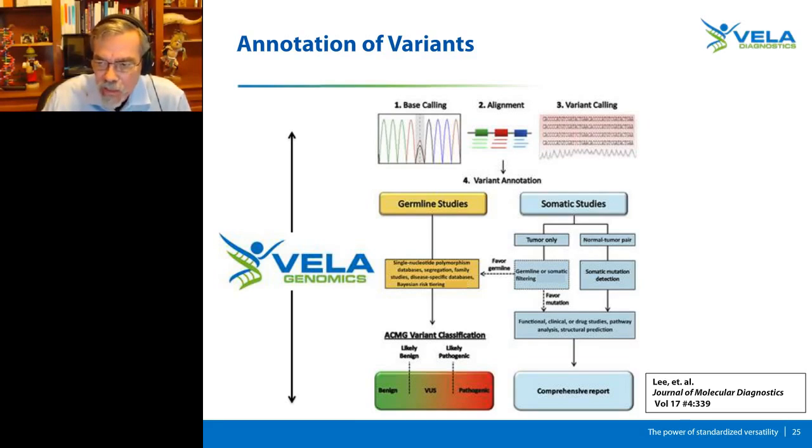If this were a recurring tumor or a metastatic cancer, then it might be possible to go back and look at the previous variants that were sequenced in the primary tumor. And this would be important to understand why the tumor progressed and if the tumor has developed resistance mutations that would affect the current treatment. Again, this is an area that continues to evolve.